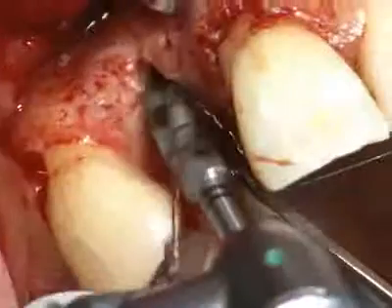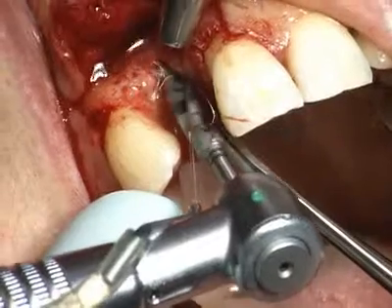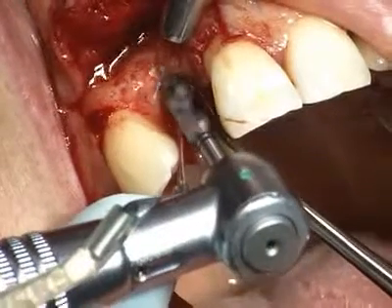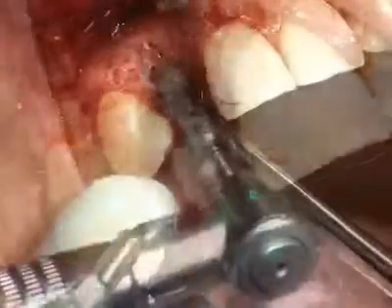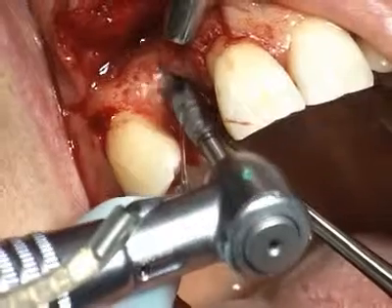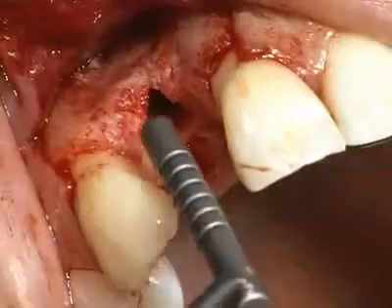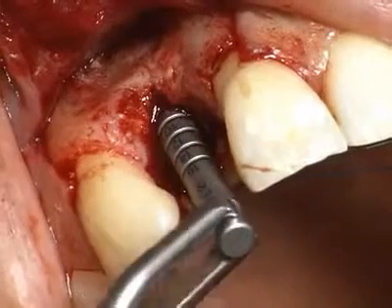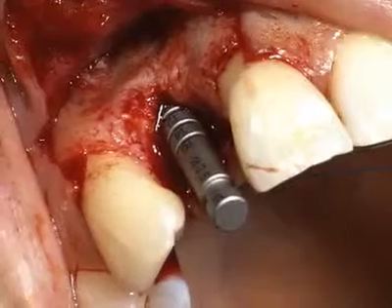For increased visibility and convenience, the pilot and twist drills are coded with a 2 mm wide black band, the upper margin of which indicates a depth of 12 mm and the lower margin indicates a depth of 10 mm. This 2 mm wide black band helps facilitate the surgical procedure as 10 mm and 12 mm length implants are the most frequently placed implant lengths.